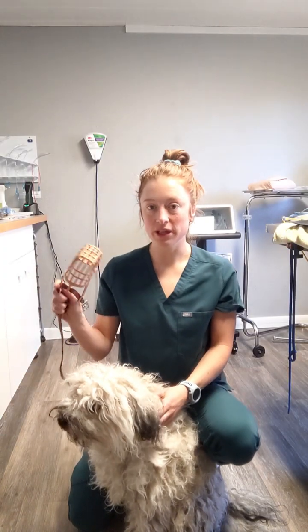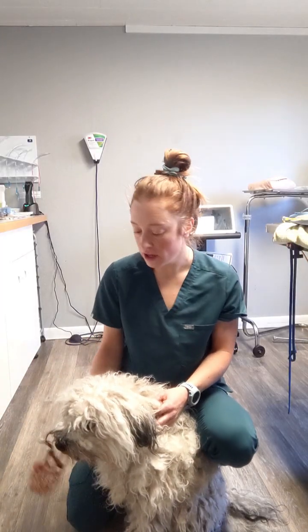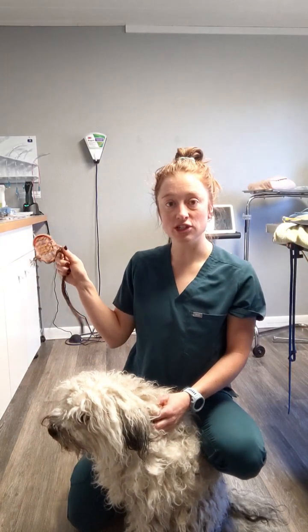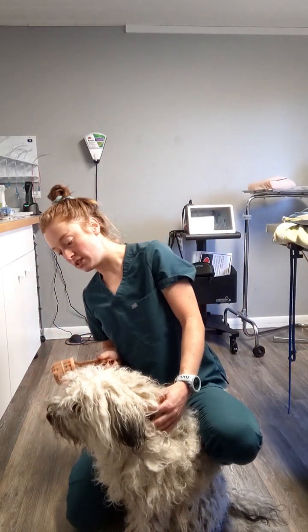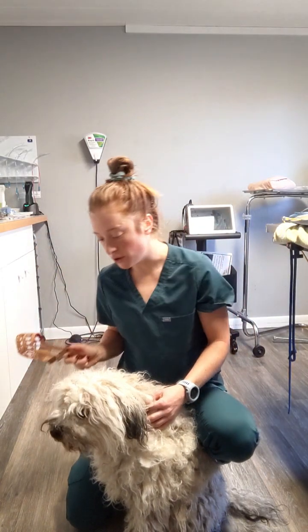So I'm going to be placing it from behind. This dog is very nice, but I want to make sure I'm not putting my hand in front of the face at all. So I'm holding it by the edge, making sure that the red part is on the top and that it is a good fit, just kind of based on looking at it, comparing it to her face.